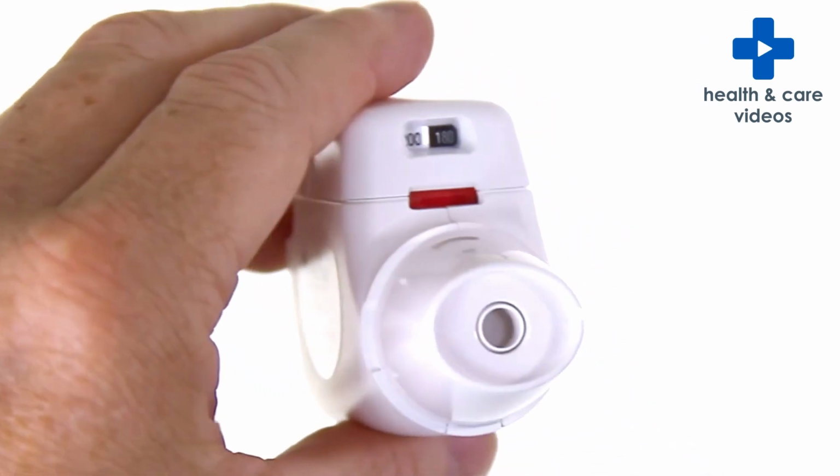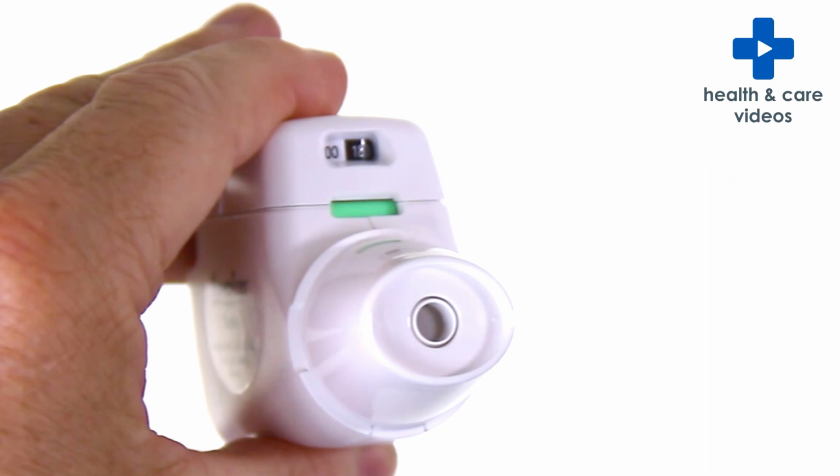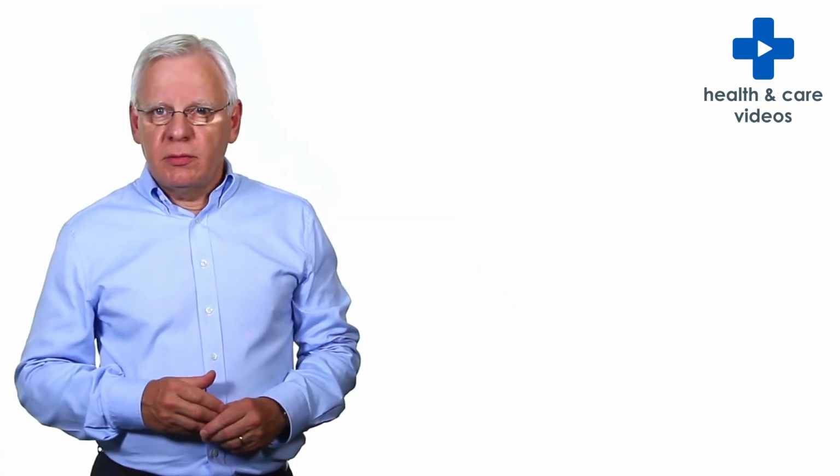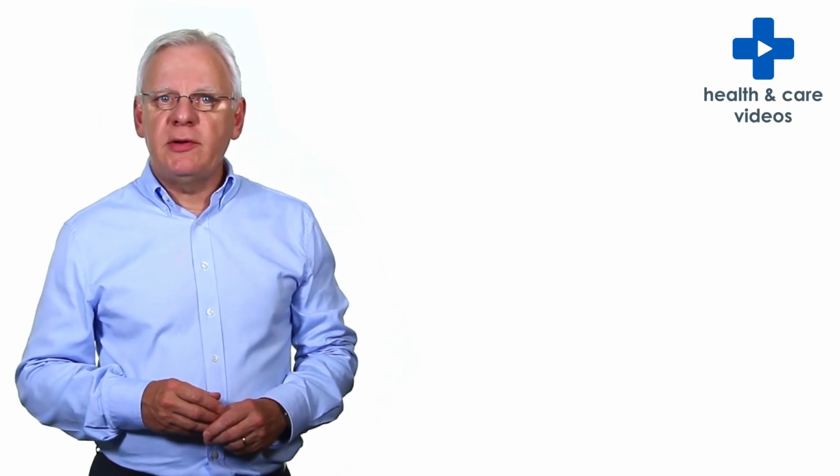You'll hear a double click and the control window will turn from red to green, indicating that the inhaler is ready to use. If the control window does not turn green, you have not pressed the button firmly enough and you should try again.